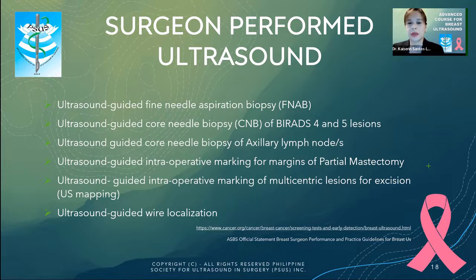It's ultrasound mapping, especially when we do our oncoplastic procedures to decrease tissue manipulation, and for our ultrasound guided wire localizations for very small lesions.